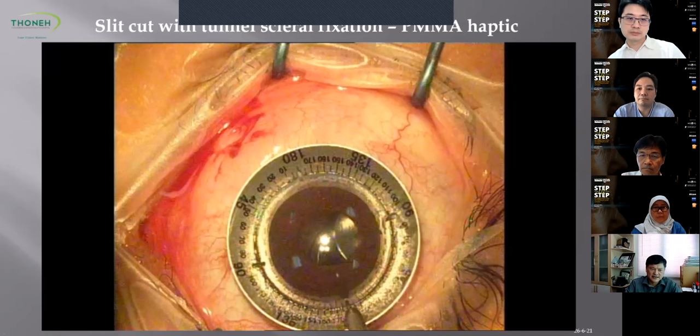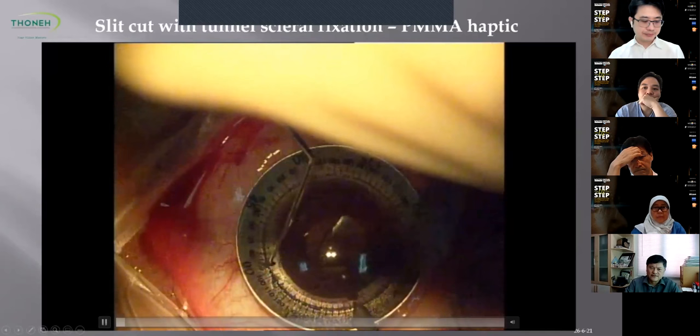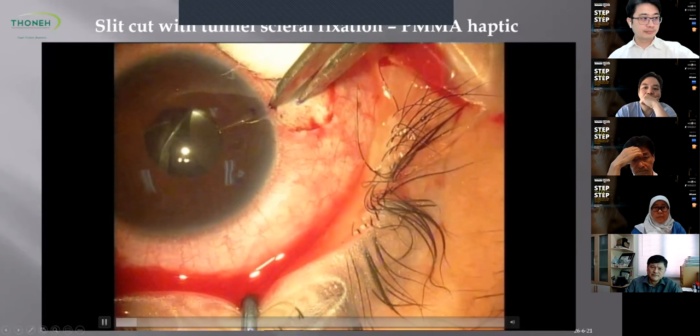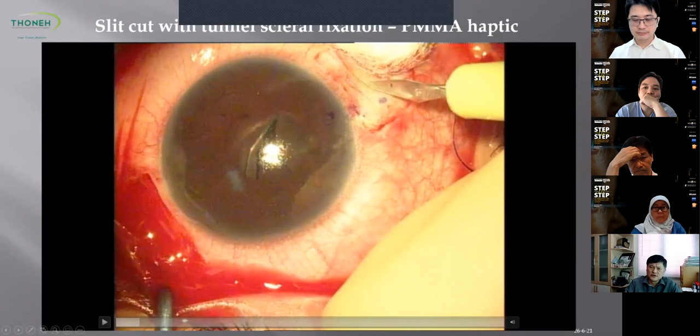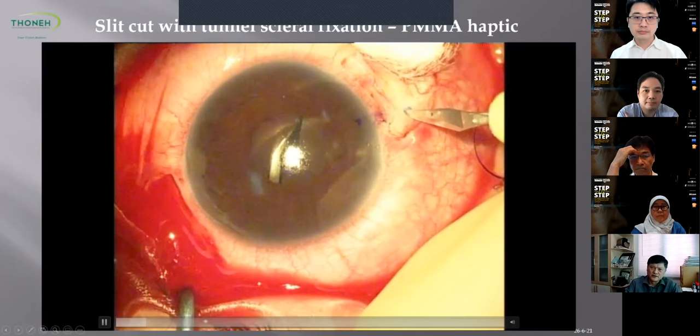Okay. Now, to begin with, I make two marks on the cornea 180 degrees away from each other. This is the site for anchoring the haptic. Then after a peritomy on both sides, I will make a sclerotomy mark 2 millimeters away from the limbus. Then this is where something is new to some of you. Using a 15 degree blade, I make a 2 millimeter in length and 2/3 in depth scleral slit parallel to the limbus, okay? Mark, cut it towards the sclerotomy. You do this on both sides.